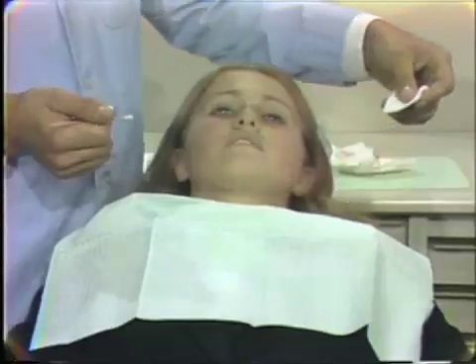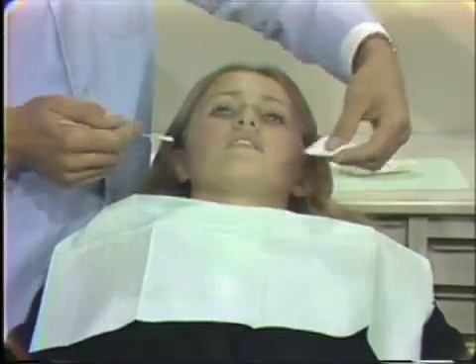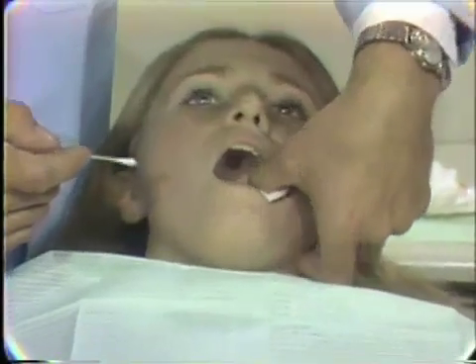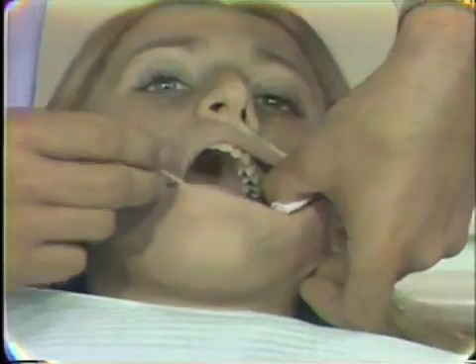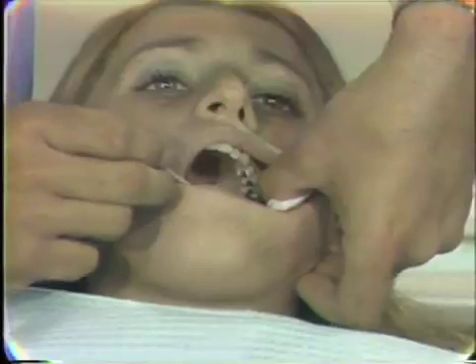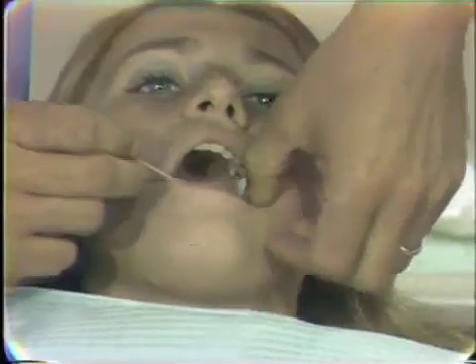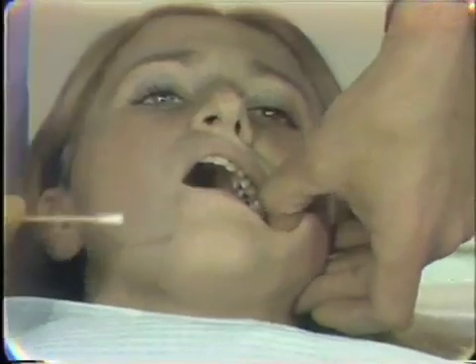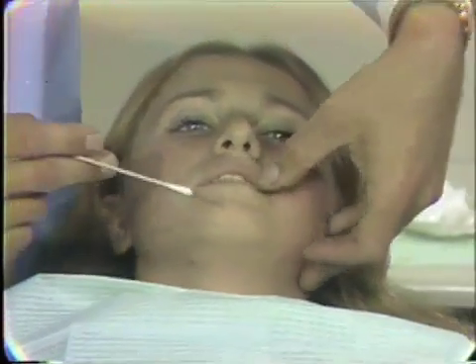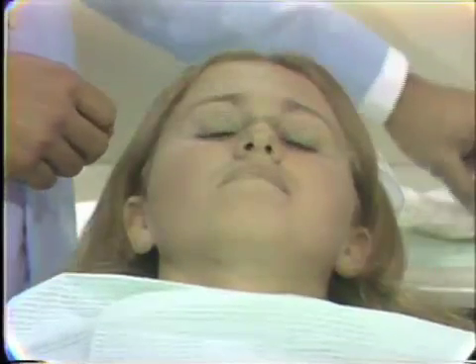When you give a mandibular injection, the cotton roll doesn't work too well at isolating in that area. But if you take a 2x2 gauze, reach back and dry the area, and then swab that with your cotton tip and topical anesthetic, press that gauze back lightly against that area and have the patient close on that and just hold that while you load your syringe, as we did with the cotton roll. By the time you get done, the topical anesthetic will have had a chance to do some work.